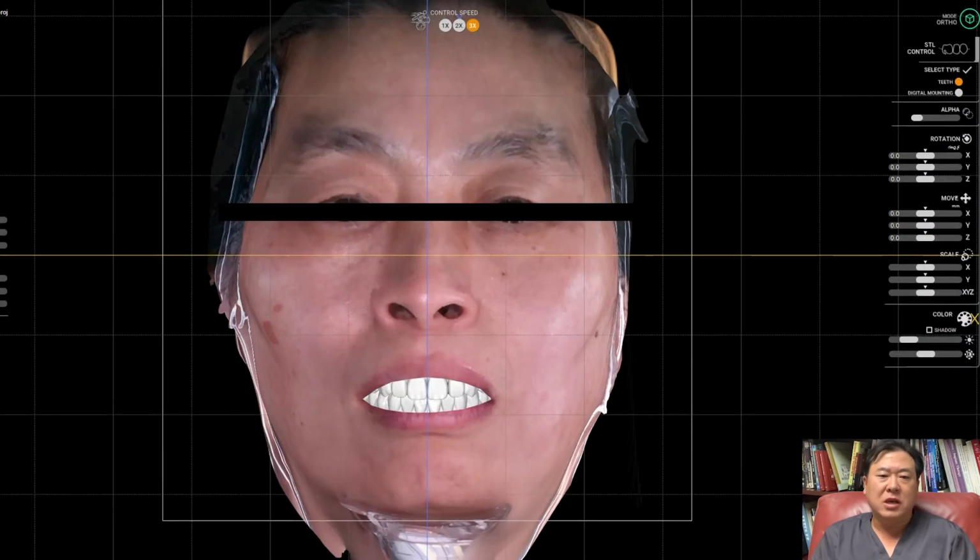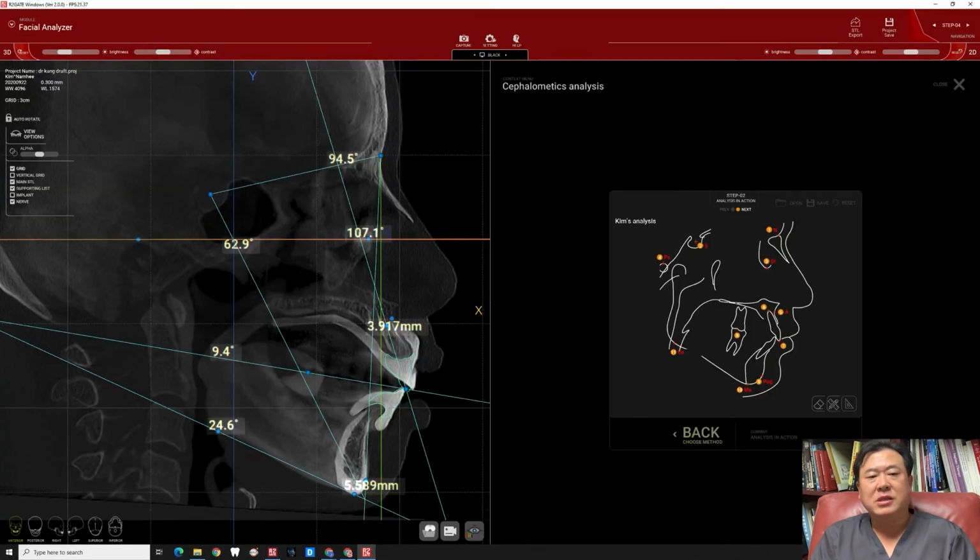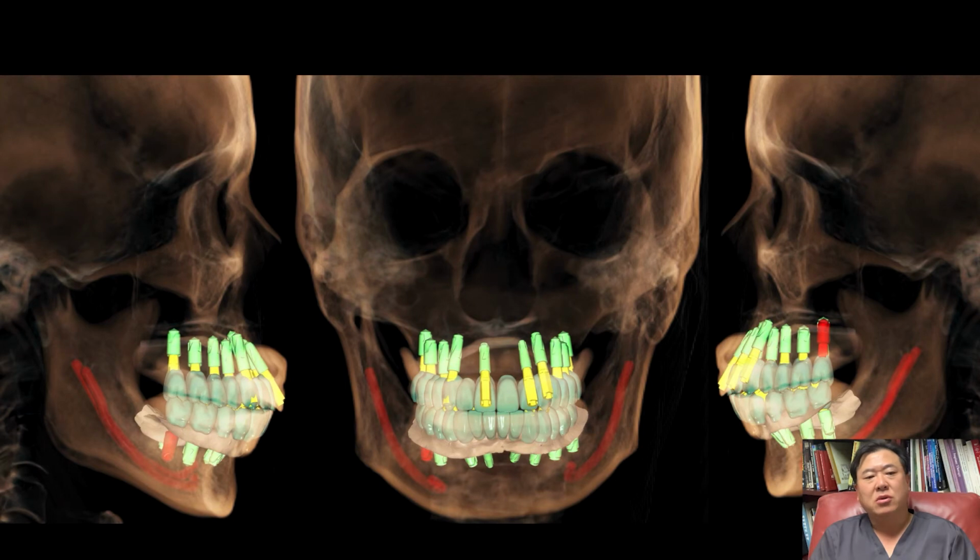And it was loaded into 3D facial scan. 3D Ceph analysis was done to evaluate the final wax-up, and everything looked so good. And based on prosthodontic planning, ideal implant planning followed automatically. I spent about a total of 2 hours to come up with this stage.